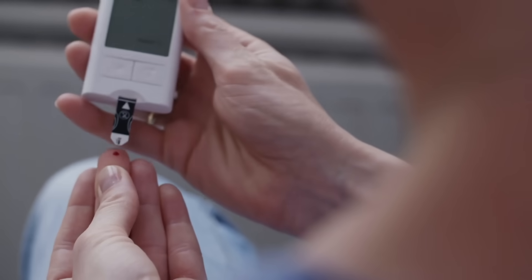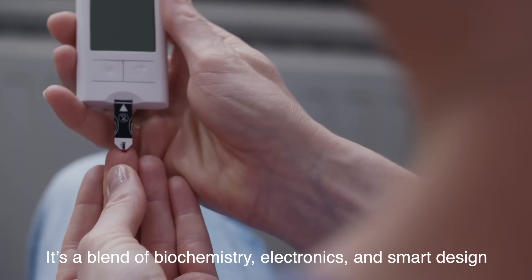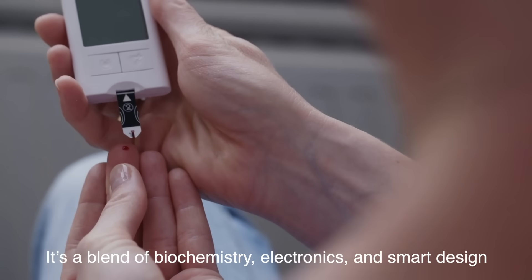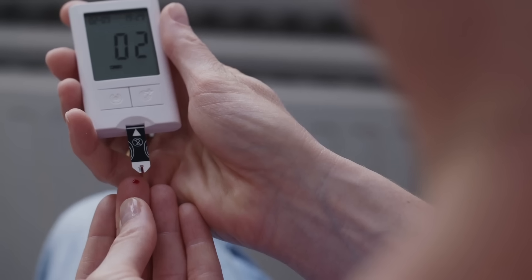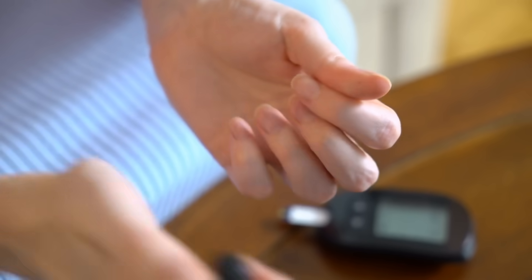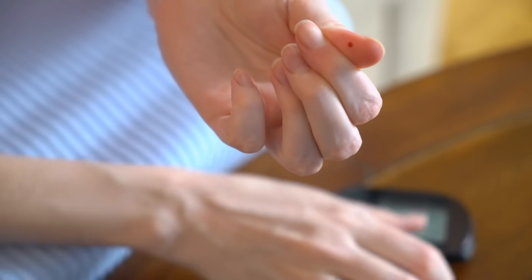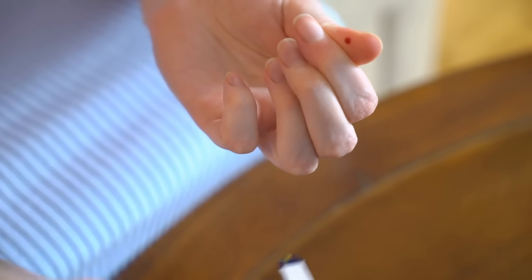So, how does a glucose meter work? In essence, it's a blend of biochemistry, electronics, and smart design. From the enzymes on the test strip to the microprocessor in the meter, every component plays a vital role in transforming a tiny drop of blood into life-saving information.